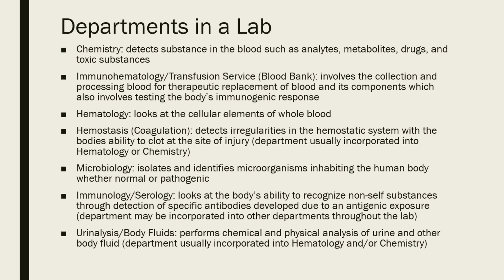Immunohematology or transfusion services, also known as blood bank. That's the department that's going to be responsible for making sure the testing is done for potential transfusion of various blood products and components. So we're checking your antigen and antibody responses. And so that department's going to use EDTA blood, sometimes serum, but mostly it's going to be your EDTA blood for your red cells and your plasma.